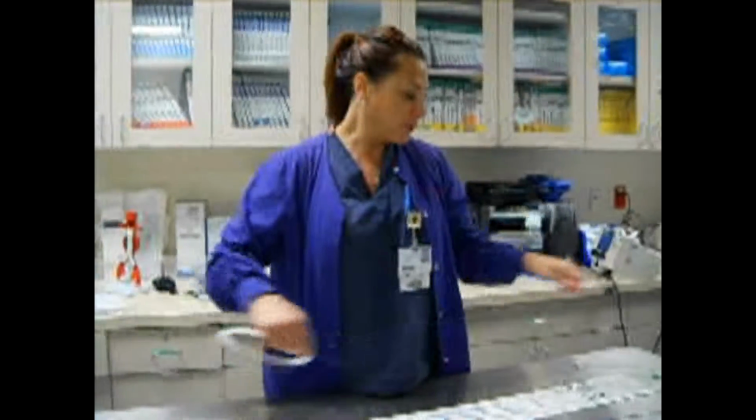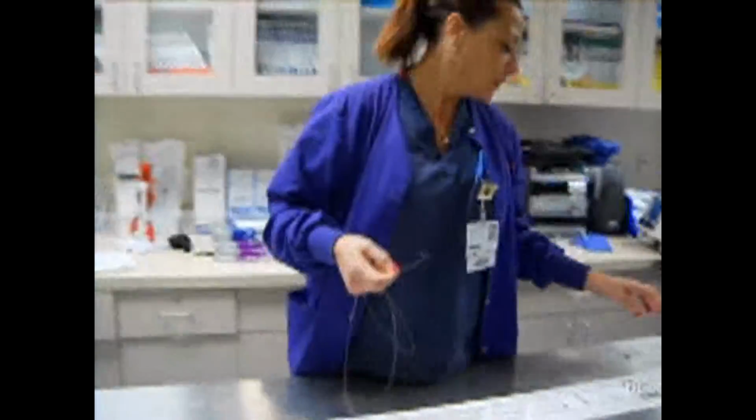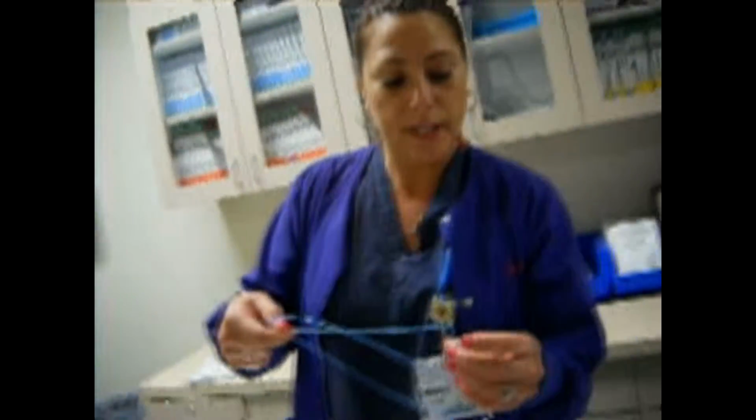So the doctor would then put the sheath in, and I would advance the wire through the catheter here. Then the physician would advance the catheter through the sheath, and it would go up your aorta into your artery. And then we would take multiple views of your left coronary artery.